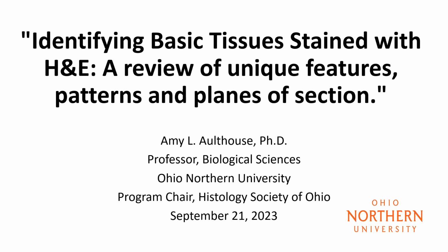But one of the things I do want to talk about is H&E, and in my 30-odd years of teaching histology, I get a lot of questions that are the same over the years. And so I thought if I could relay some of those helpful tips, that may help people be able to identify basic tissues by just using H&E. Now, some of the things we need to think about is, what are the basic features that we're going to be looking for? What are the patterns? And of course, we always have to think about plane of section.